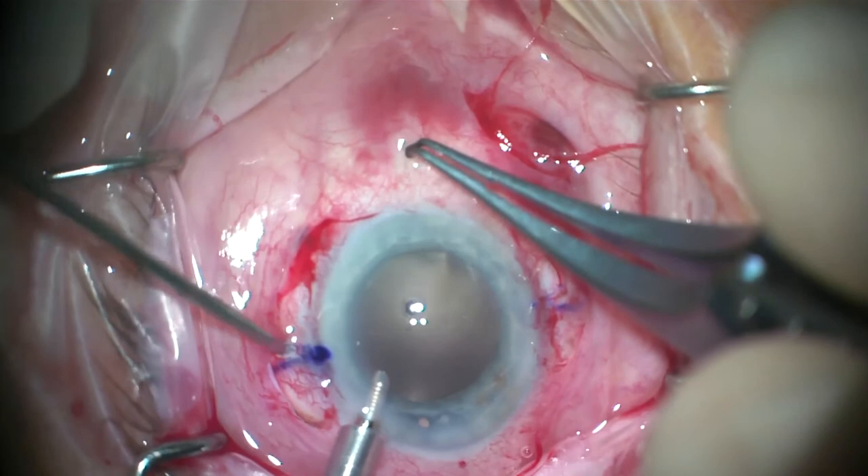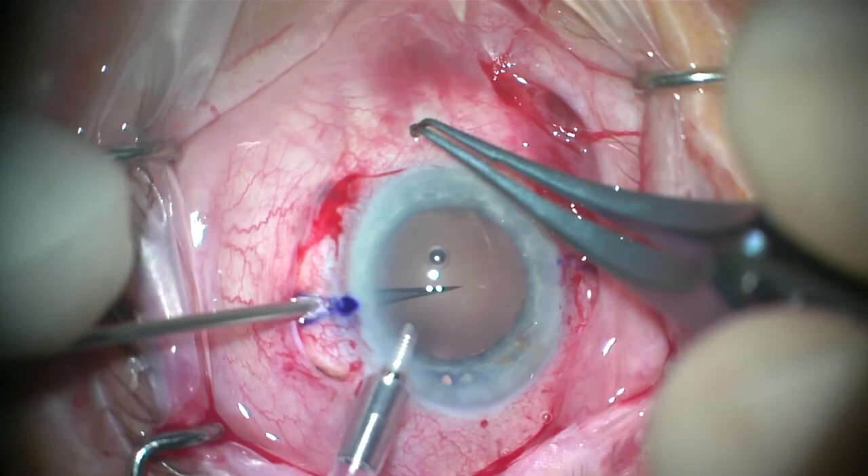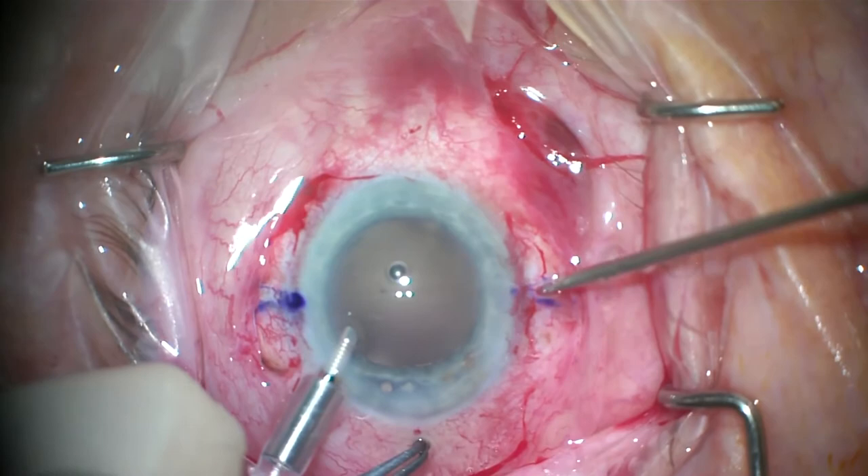The same is repeated on the opposite side. The creation of the stab incisions is angled at 30 degrees, using the blade parallel to the limbus and directed inferiorly.